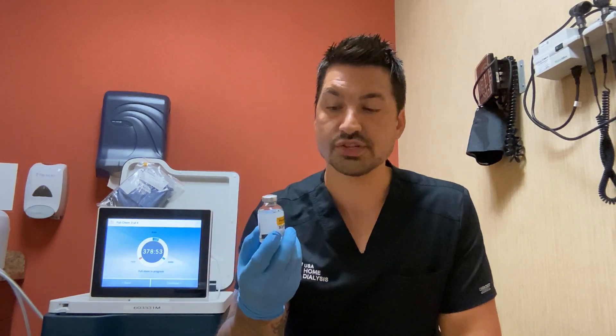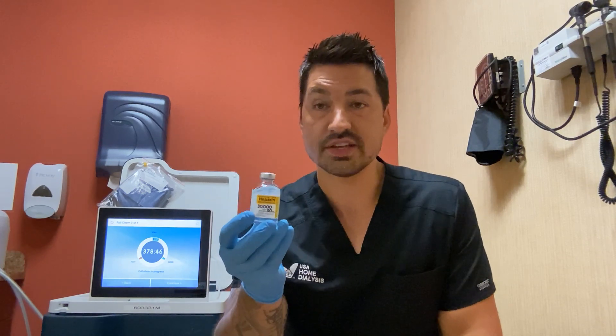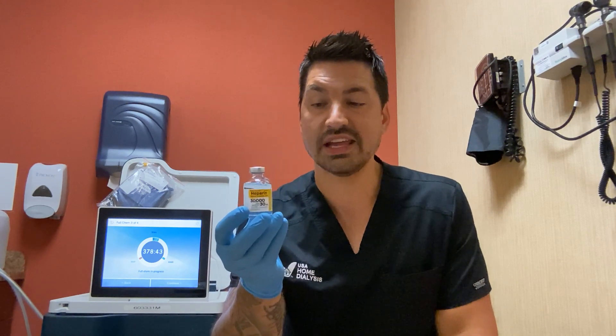Please discard any medication that you have at home that is expired. Lastly, the concentration of your medication. This heparin, as you can see, is 30,000 units in 30 ml, so the conversion is 1,000 units per ml. Always know your concentration.